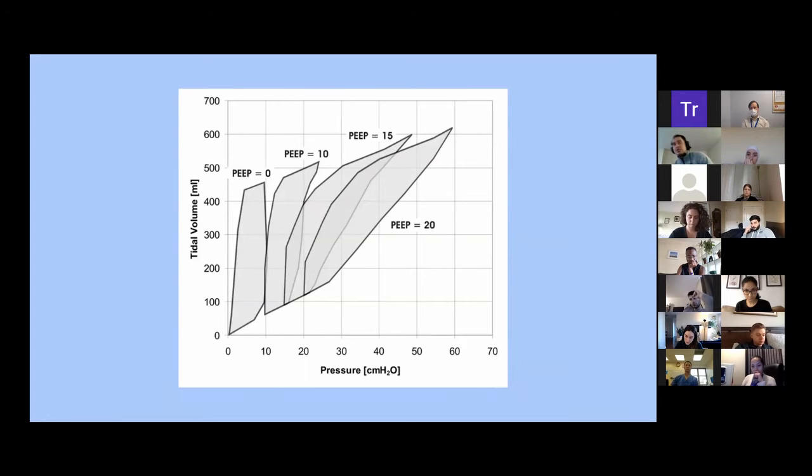The other important relationship that you have to understand about PEEP is that whenever PEEP is necessary, it usually falls within the scenario of patients that have very low lung compliance. Meaning, for example, patients with ARDS or cardiogenic pulmonary edema, which is our bread and butter in the CCU and the MICU. So what PEEP achieves with these lungs is that it improves the compliance. So always remember that the main pathophysiologic mechanism of both cardiogenic pulmonary edema and ARDS is that drop in the compliance of the lung. The lung becomes very stiff and very difficult to ventilate. So the more PEEP we provide to those lungs, the more those lungs become compliant and easy to ventilate.